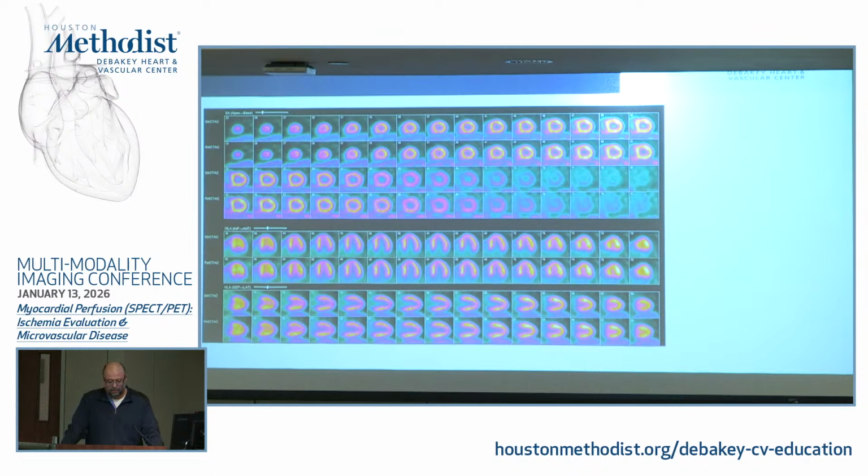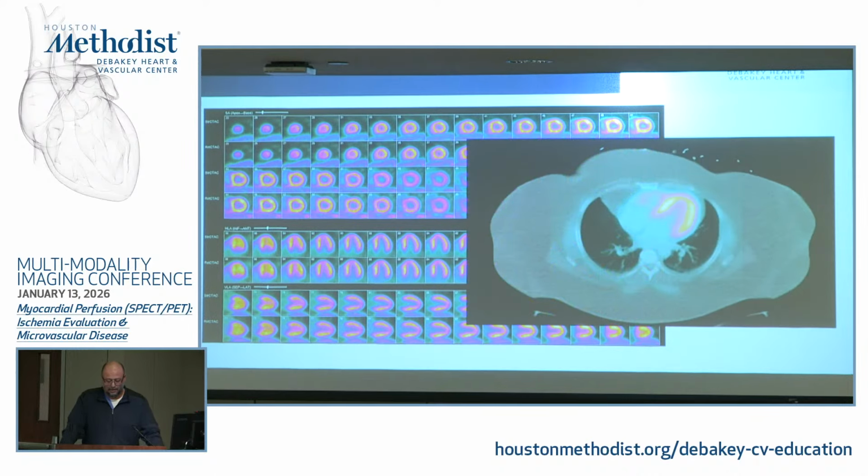This is the image of one of the big size patients that we have. So you can appreciate the quality of the images compared to the SPECT images that you've seen before. This is a BMI of 76. So this is not, again, the biggest. We still have a couple bigger, higher BMIs. Our table limit is, I think, 550, but this was a short patient, so that's why the BMI is pretty high. And you can see here all the subcutaneous fat that's there.